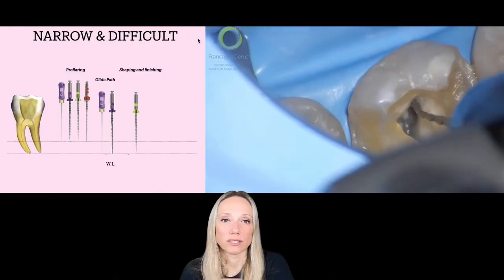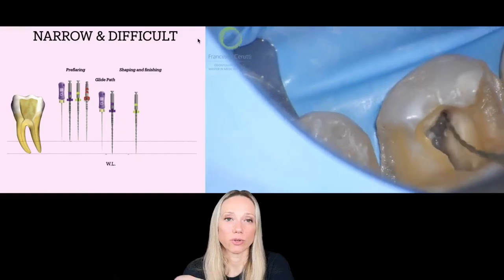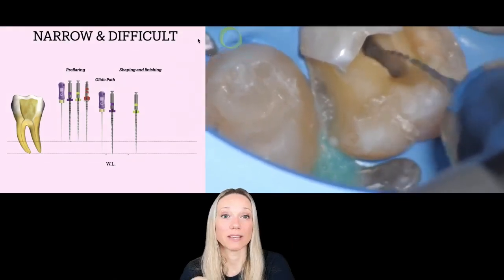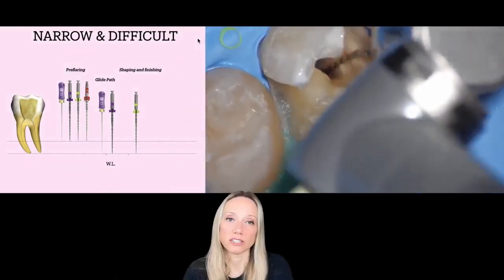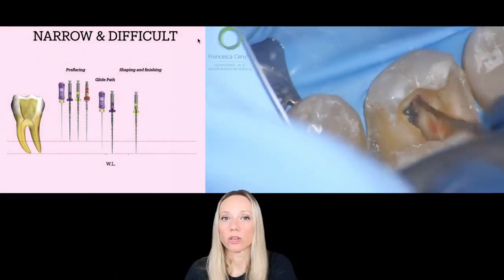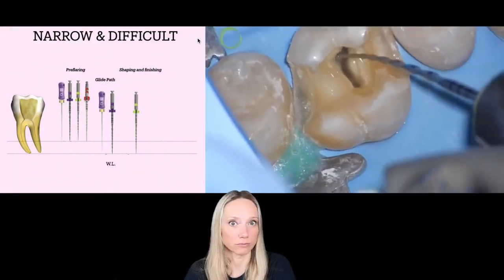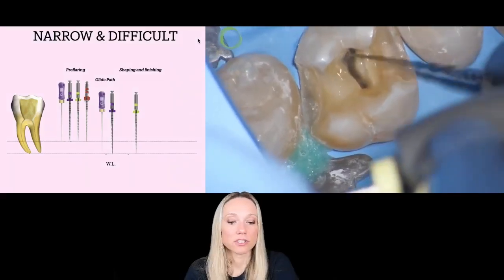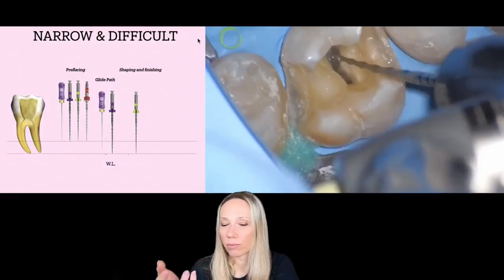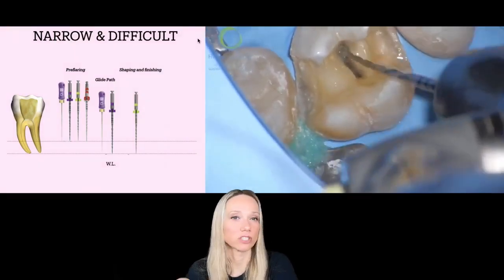What are we doing in this case? We are removing all the dentine that is going to create an interference coronally for our files, and that is going to make it harder for our files to proceed inside of the root canal. We remove the interferences, our files are working better, we don't have the transportation of the root canal, and we decrease the risk of fracture. So it's just a step that takes you a few minutes to be completed, but it's completely worth it because you work better and you work safer.